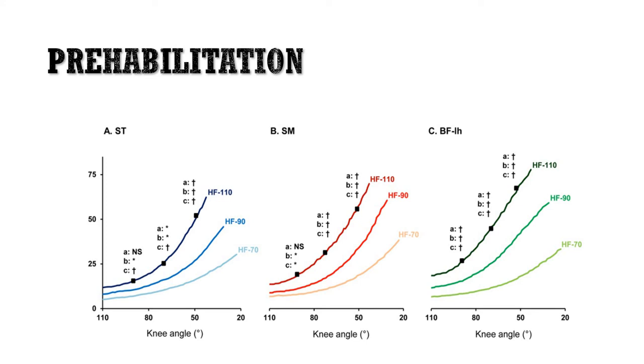We're all capable of lifting our, I don't know, legs up and bending our knee over our neck and so on, but we need to overcome the stretch reflex first. That's not necessarily, there are some that would disagree with that and say that you actually need to lengthen the tissue as well, but that's a story for another day. But what we're basically seeing here is muscle activity in terms of the stretch reflex.